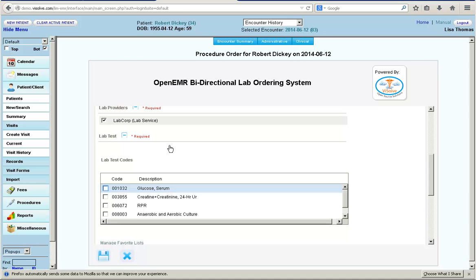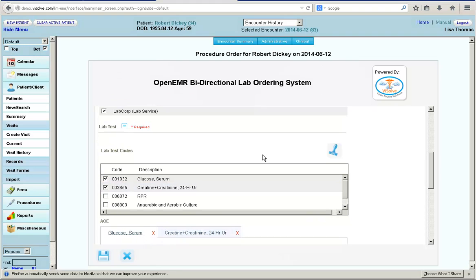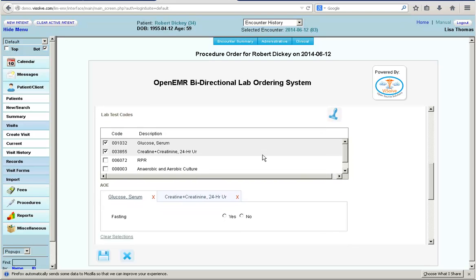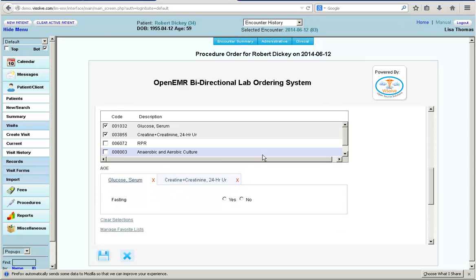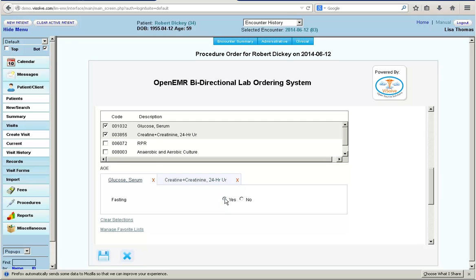Then, Dr. Lisa selects the appropriate test code. The system lists any Ask at Order Entry (AOE) questions and the doctor selects the responses for the questions.